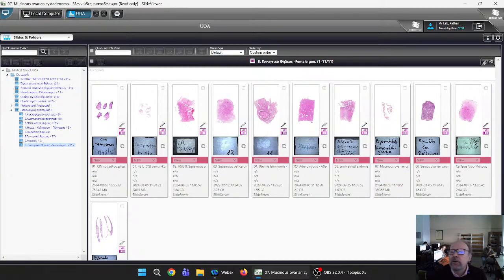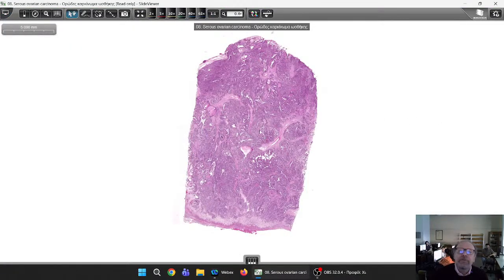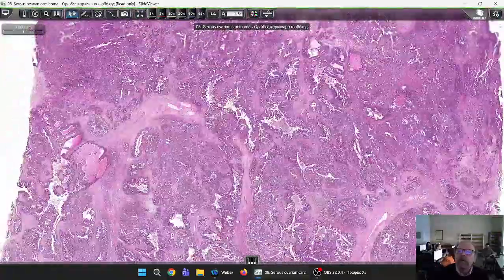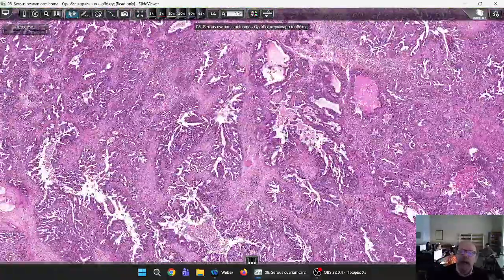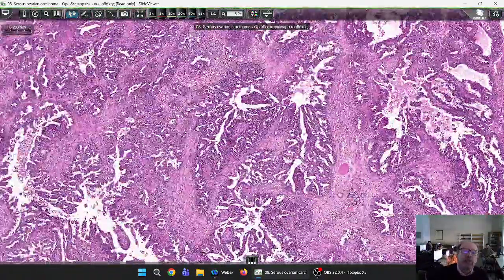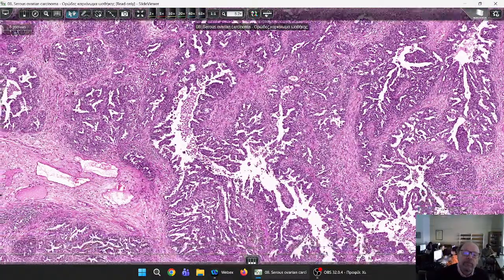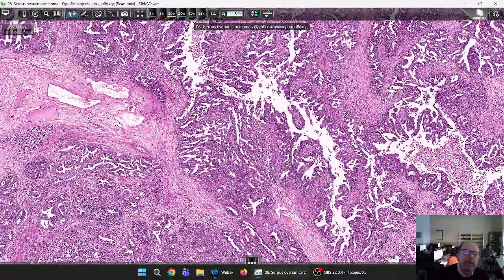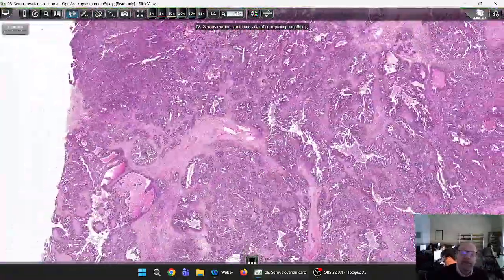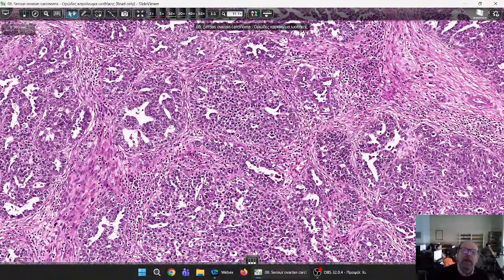So now let's have a look at the serous adenocarcinoma of the ovary. It most commonly forms these structures, which now that you are experts in pathology, I'm sure you will identify them. What are these structures here in this tumor? Look, they are very common in many. You can identify them in many. What are these structures? There is a solid component here, a glandular one.